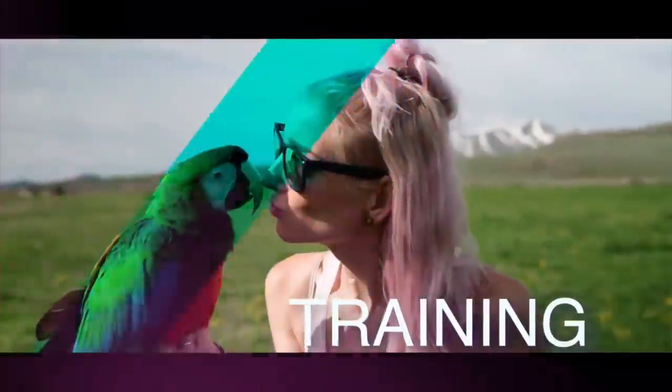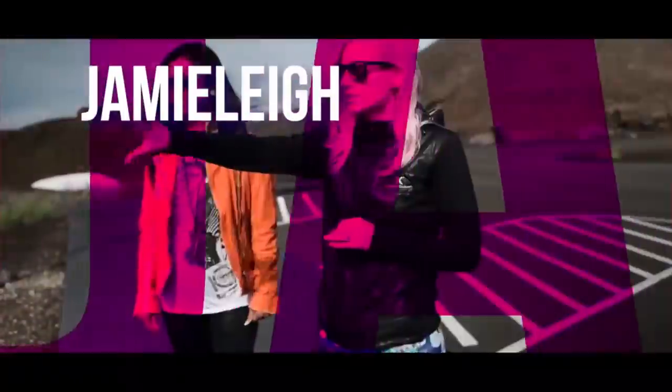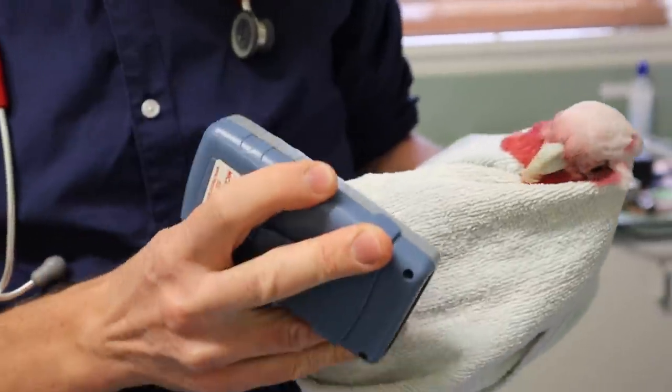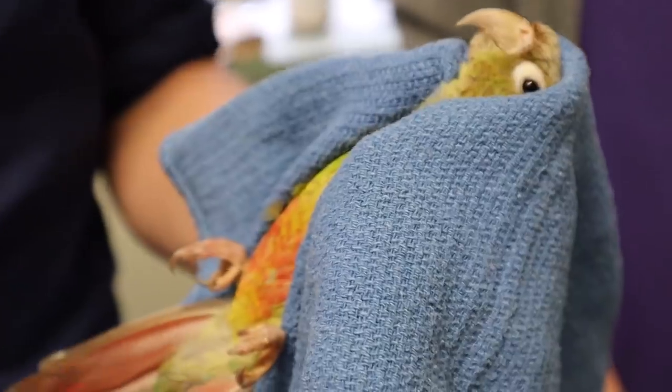Hey guys, Jamie Lee here from BirdTricks, and I have a really fun activity that we're doing today — maybe not so fun for the parrot that's going to be involved — but I'm hoping that it's super educational and convinces a lot of you guys to do the same with your birds at home. What I'm talking about is microchipping your parrot. I've done this with my entire flock, from as small as my 100g sun conures all the way up to my 950g macaws.